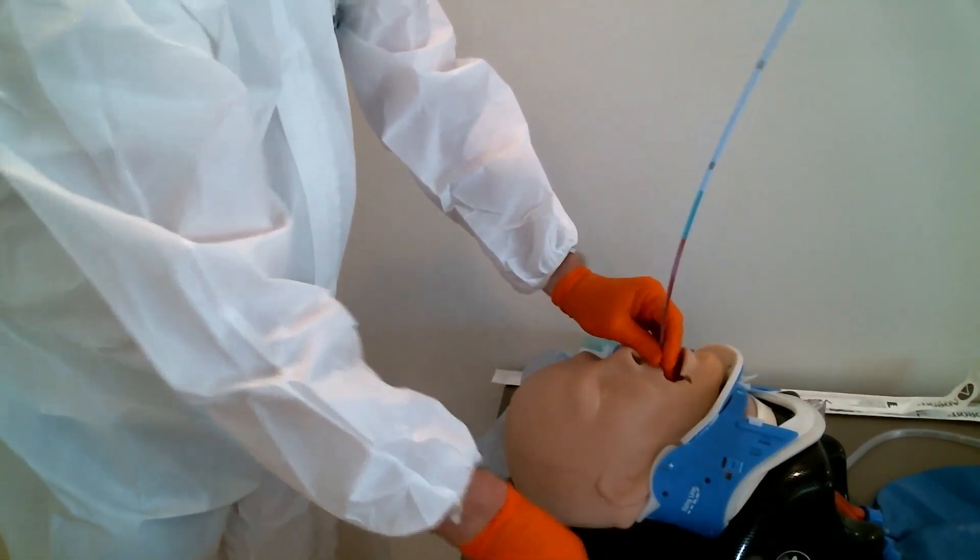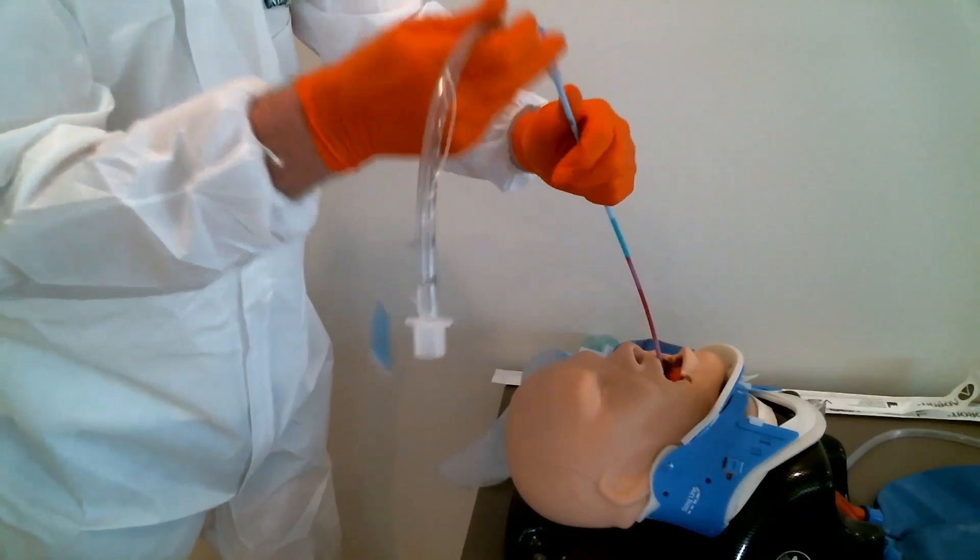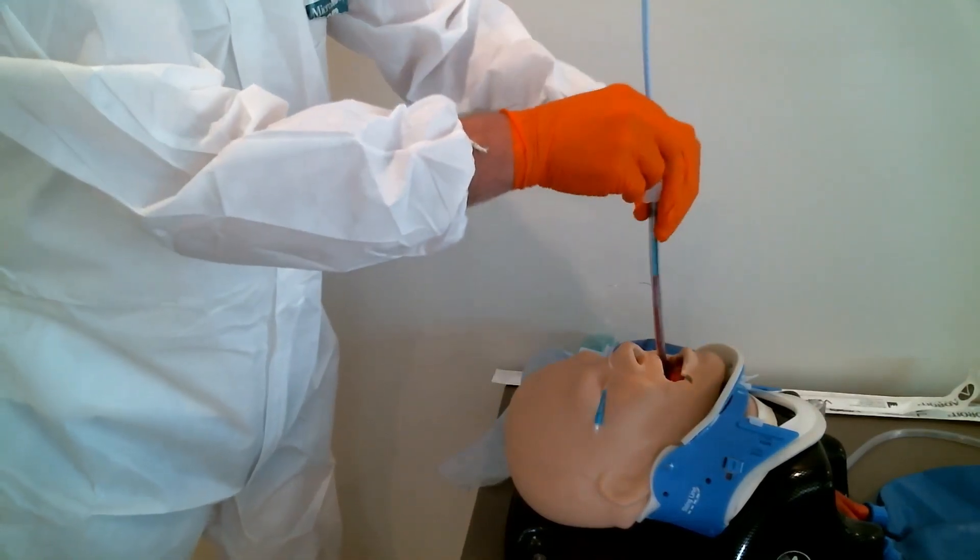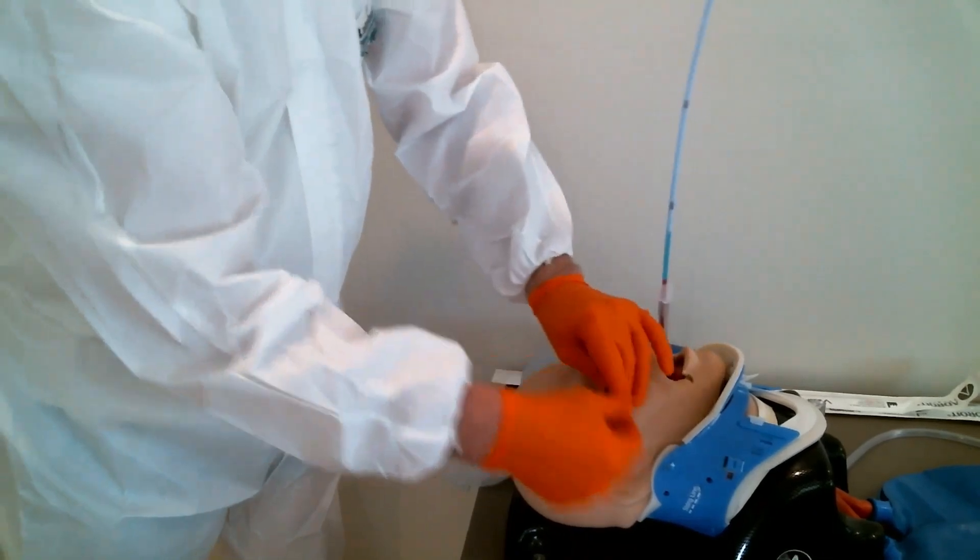Now I'm away from the face. I'm selecting the proper tube size. Follow your local protocols for depth. Inflate the cuff.